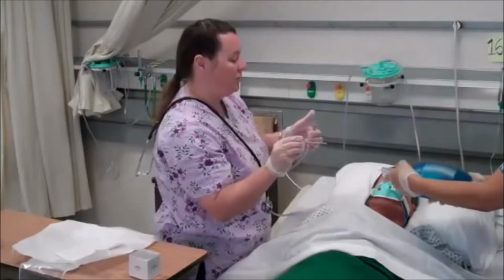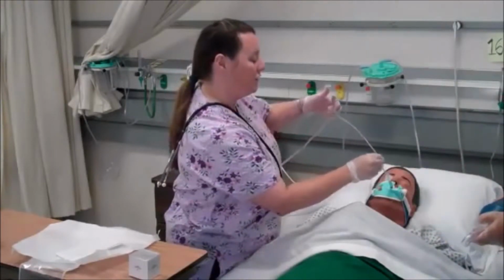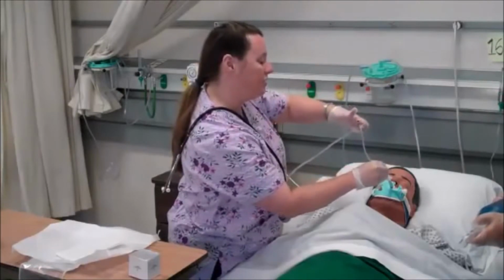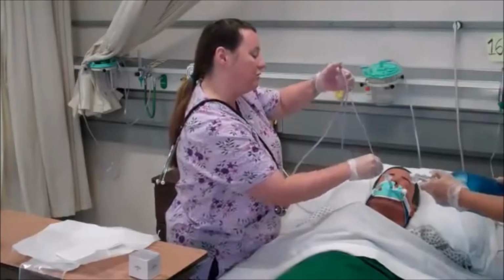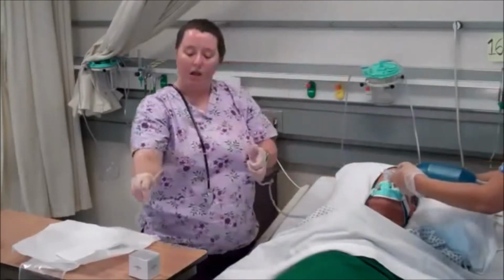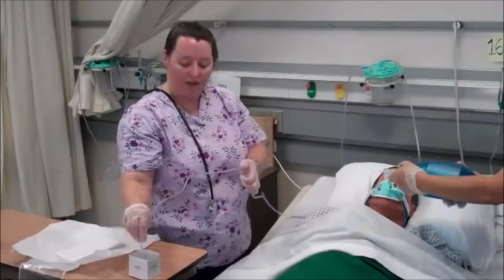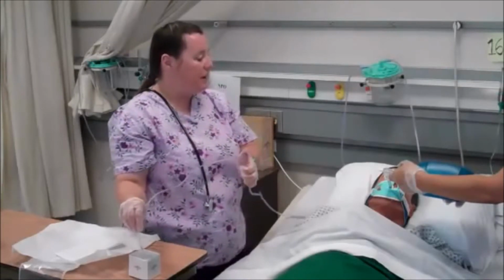Again, the patient is going to be removed from the oxygen source. I'm going to go down again, sterile technique, not touching that tube to my hands. I hit resistance, patient starts to cough, I pull up 1 centimeter and apply intermittent suction as I pull that tubing out. Twisting and twirling as I come out. I'm going to go ahead and clear my tubing again. Kathleen is applying supplemental oxygen. And I'm going to again reassess my patient.